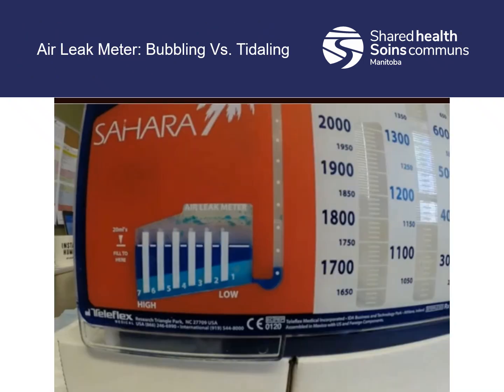So we're going to look at what the bubbles mean. When we look at the bubbling in the water seal chamber, in the lower left corner of the device, we can see the air leak meter. Inside this section of the PleuraVac is a one-way check valve. It allows air to exit, but doesn't allow air to enter back into the device. You don't need water to create a seal, like I mentioned before. It can just be air. But what the water is really used for is to detect air leaks from the chest cavity, to check the bubbles and see which is a greater leak.